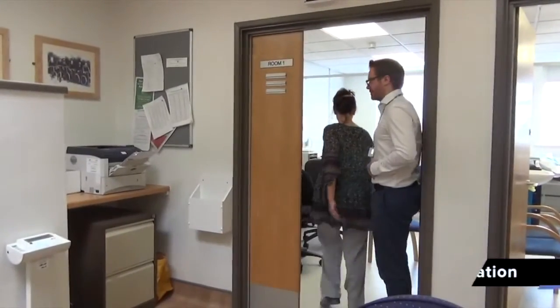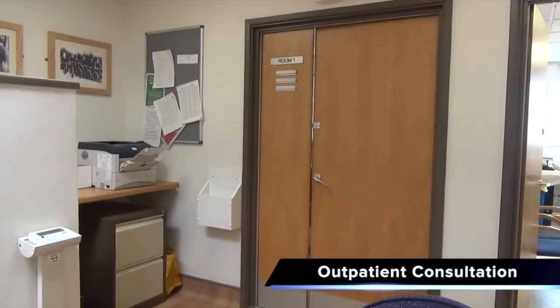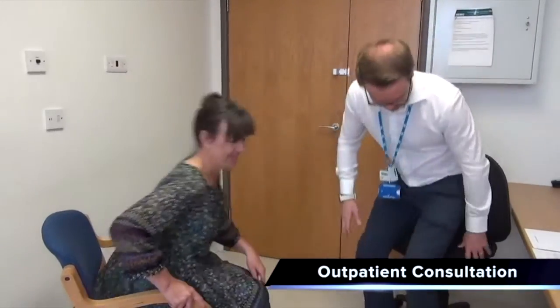The process begins with the patient attending an oncology outpatient appointment where they will be advised on a management plan for the treatment of their cancer. Your recent biopsy has demonstrated you have what's called a glioma, which is an aggressive brain tumour, and we need to offer you a course of chemoradiation with the hope of controlling it. The patient is taken through the treatment process in which the technique, dosage, timings and possible side effects are discussed.